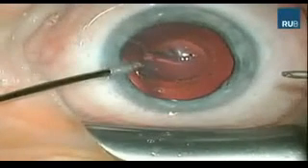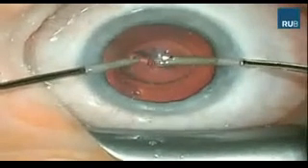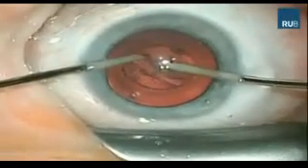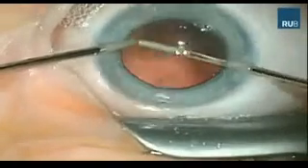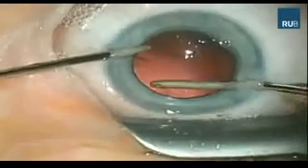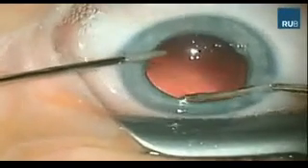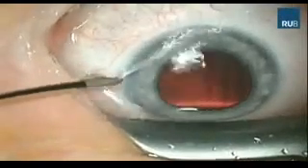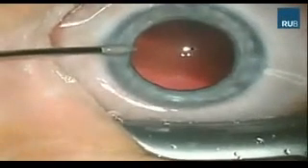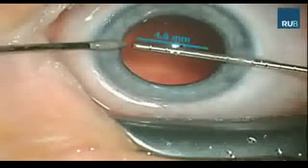The nucleus and the cortex are removed using bimanual irrigation aspiration handpieces, followed by the polishing of the posterior capsule as well as the backside of the anterior capsule. After meticulous cleaning of all epithelial remnants, the capsulotomy diameter is measured horizontally using the Engel measurement device. The measured diameter is 4.6 millimeters, which is exactly what we aimed for.